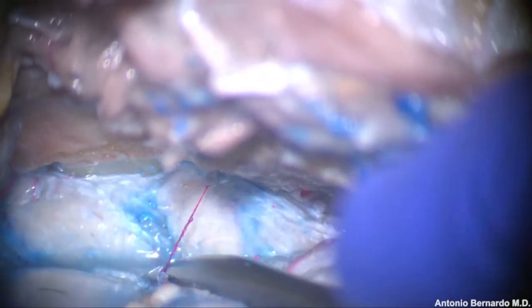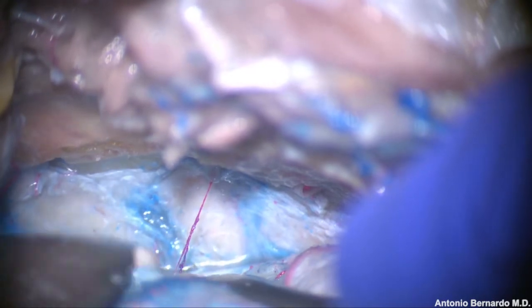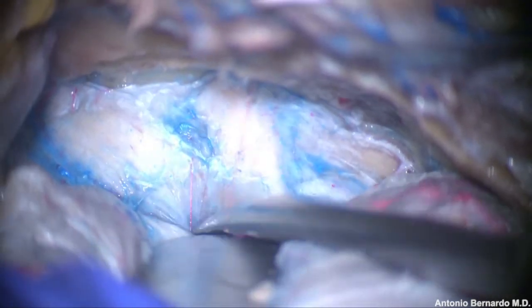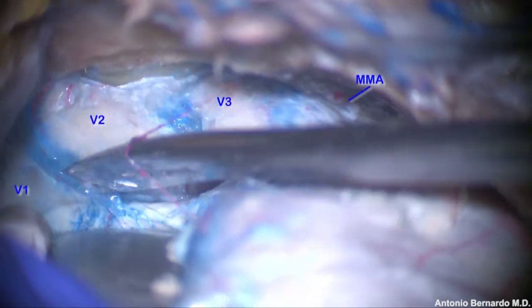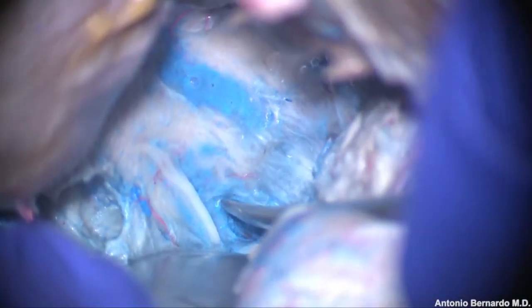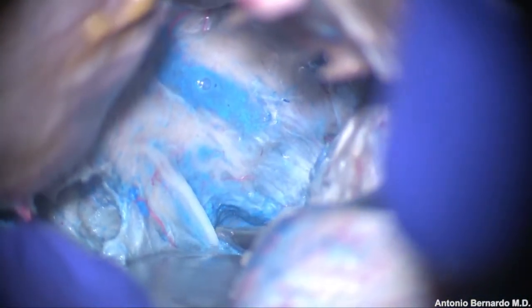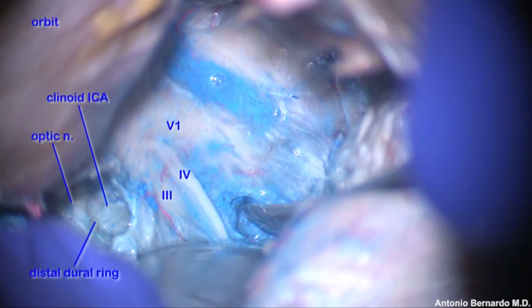The dissection continues posteriorly in between these two dural layers, and finally the temporal lobe is free from its attachment and can be lifted and separated from the lateral wall of the cavernous sinus. Most of the lateral wall of the cavernous sinus is now exposed.